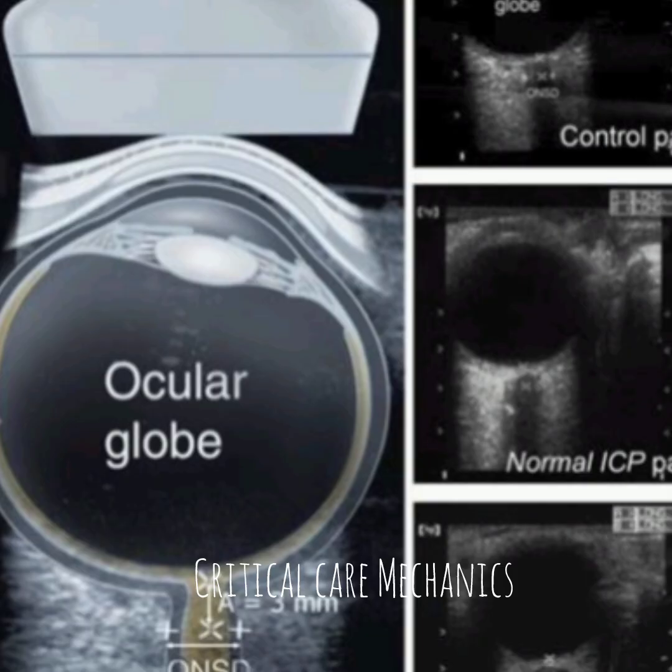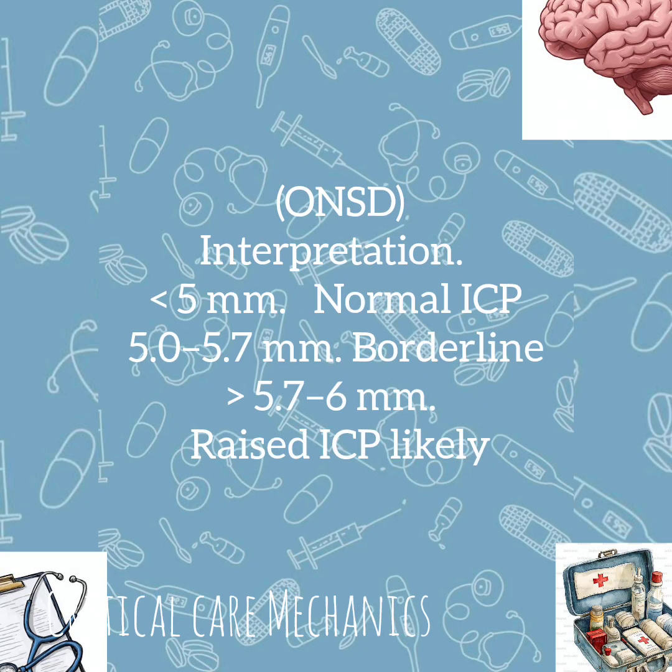Normal versus abnormal values. ONSD interpretation: less than 5 mm, normal ICP. 5.0 to 5.7 mm, borderline. Greater than 5.7 to 6 mm, raised ICP likely. Cutoffs may vary slightly depending on population.